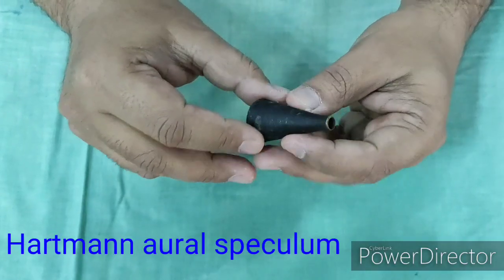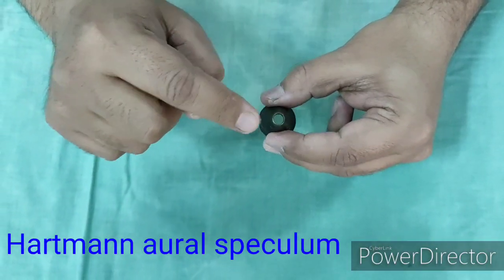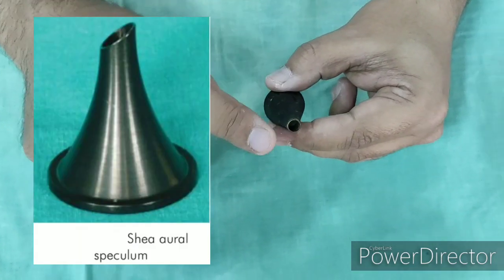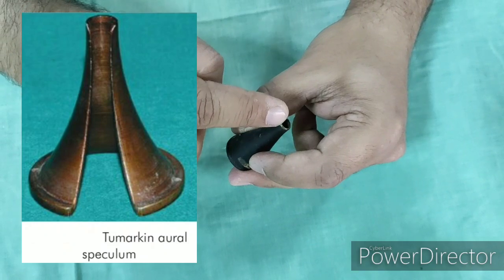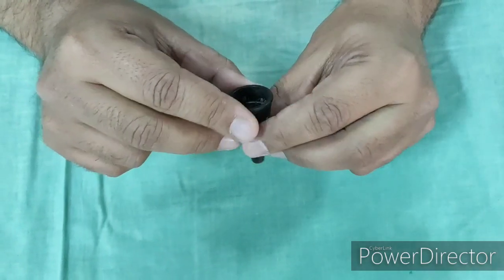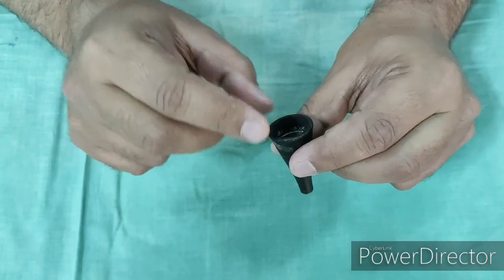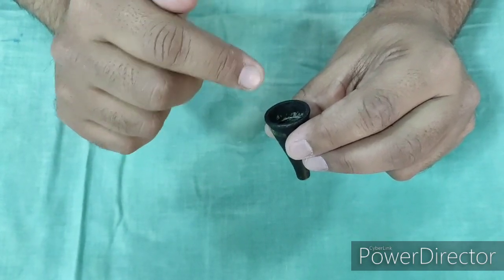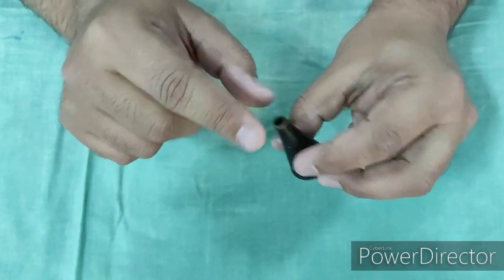This is an ear speculum. Ear specula come in different types: this one with a round end is a Hartman's ear speculum; when the end is bevel-shaped it is Shea; when there is a partial cleft it is Rosen's; and when there is a complete cleft it is Tumarkin. The uses of this instrument are: to examine the ear, to clean the ear of any fungal infection, to instil ear drops and medications, to inject local anaesthesia in the ear canal in surgeries, and for microscopic examination and suction cleaning.